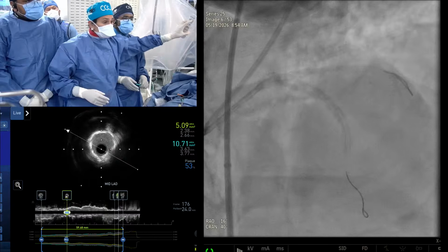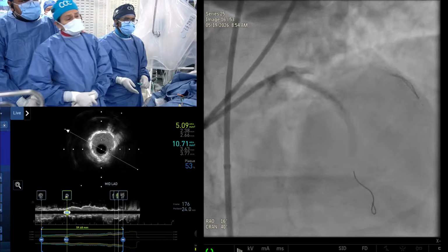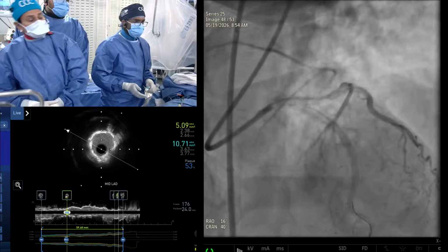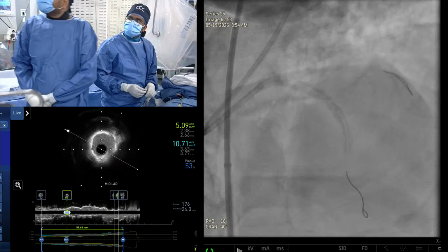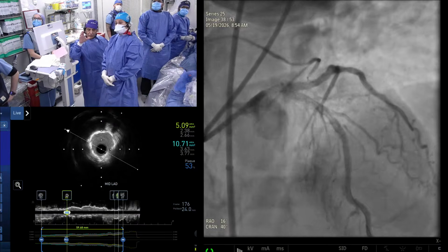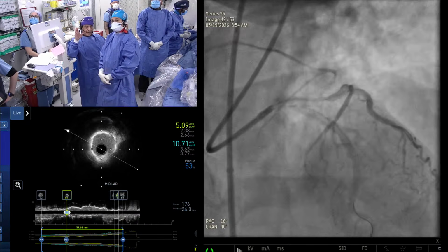Yeah. Okay, good. Outstanding. I mean that area after septal, probably. Just, no, septal and just at the level of the diagonal. Angiographically also you see it. There is a 20-30% narrowing. So as much as you can go, we also know if you become too crazy, you'll rupture the vessel. Yeah. Even with the calcium and stent.